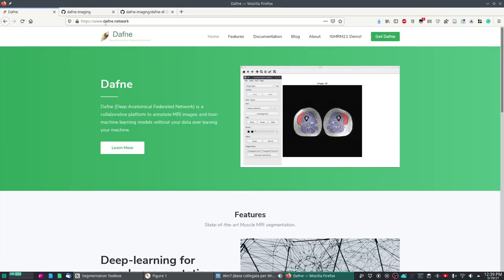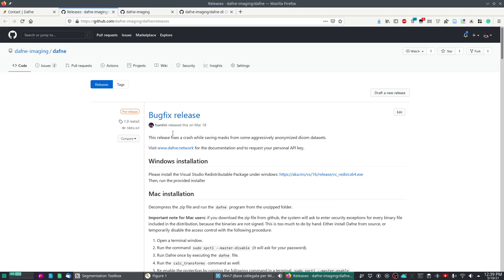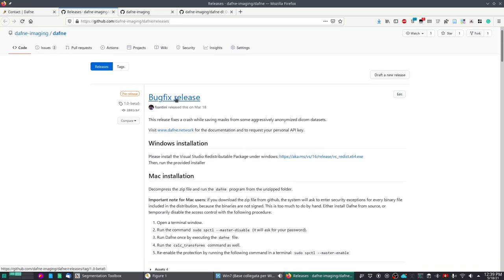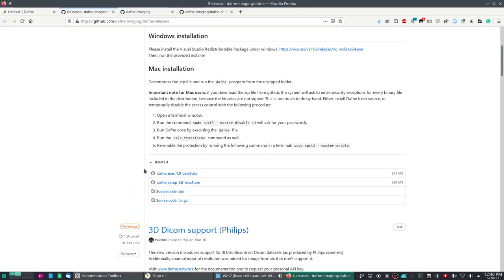If you go to daphne.network you will reach the website. To download the program, click on the Get Daphne page and from there you can directly access the GitHub release page. On the release page you will obtain the latest release, which will always appear on top. Clicking on Assets gives you a Windows installer (.exe file) and a Mac installer, which is a zipped package you can unzip on your Mac.